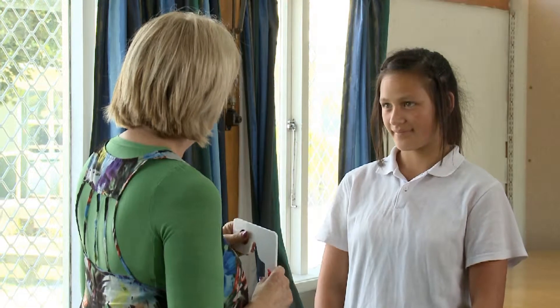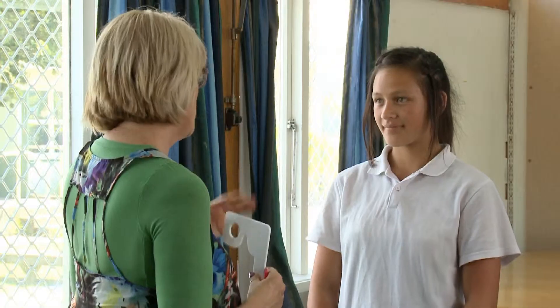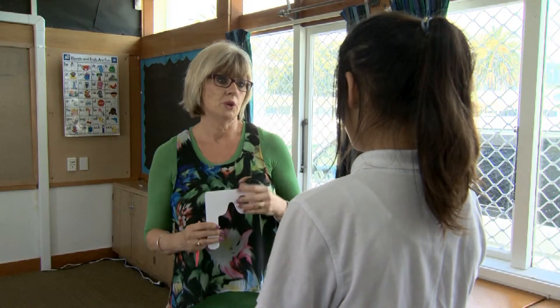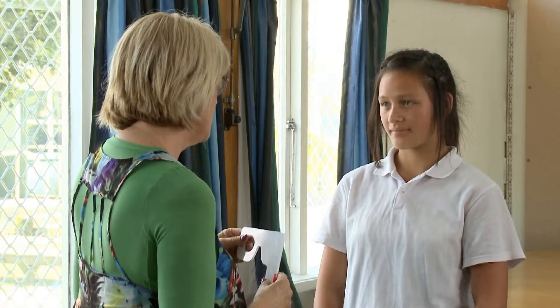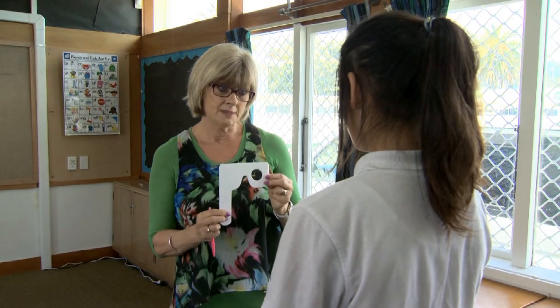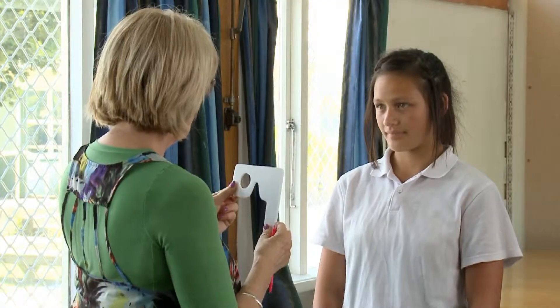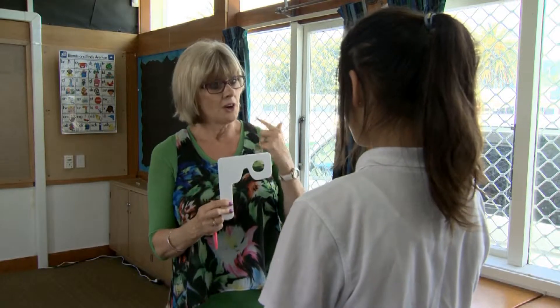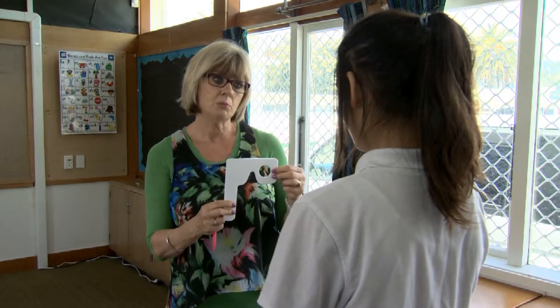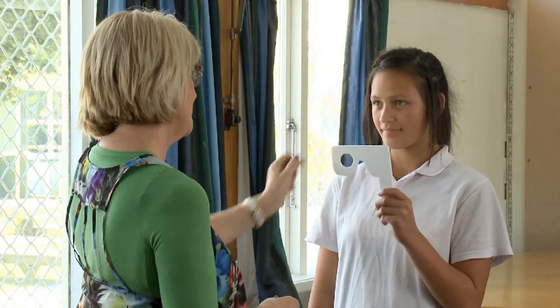Okay now Pera, you've come here today darling because I need to check your eyes for you. Because you're in Year 7, everybody at that age group has a vision check because it's quite common for your eyes to change and you not be aware of it. That's the reason for the mask. So when you pop the mask on, this needs to sit on your nose so that the hole goes in front of your right eye first. And then I'm going to go to the eye chart and I'm just going to point to some random letters and you just need to tell me what I point to.